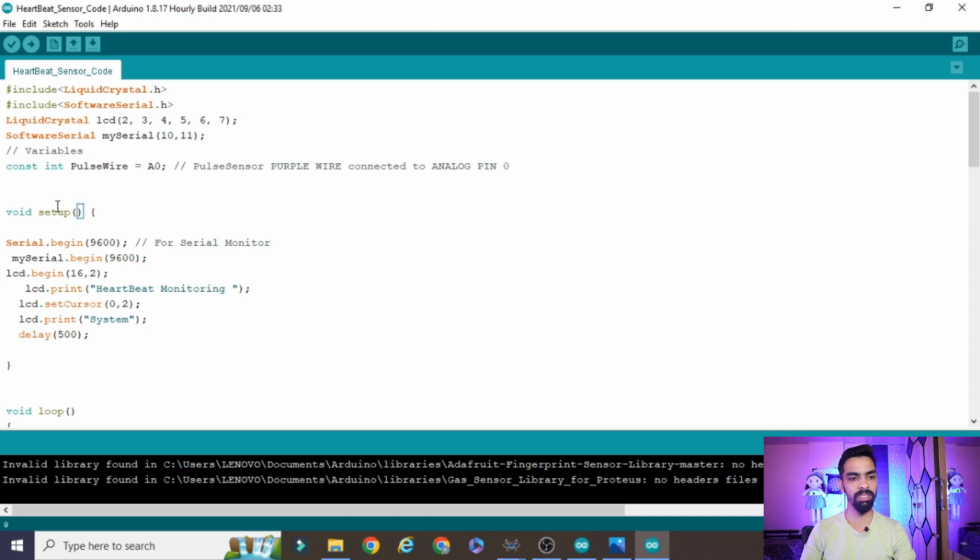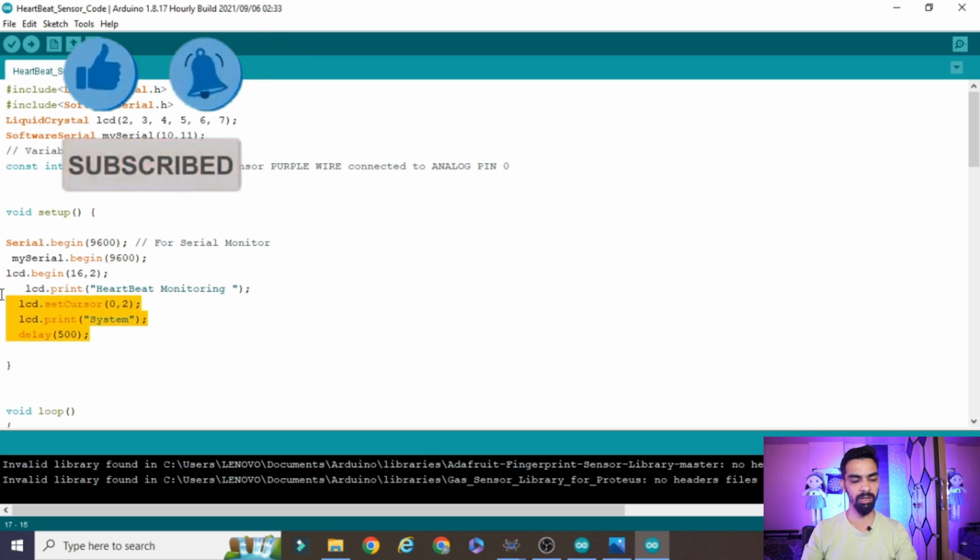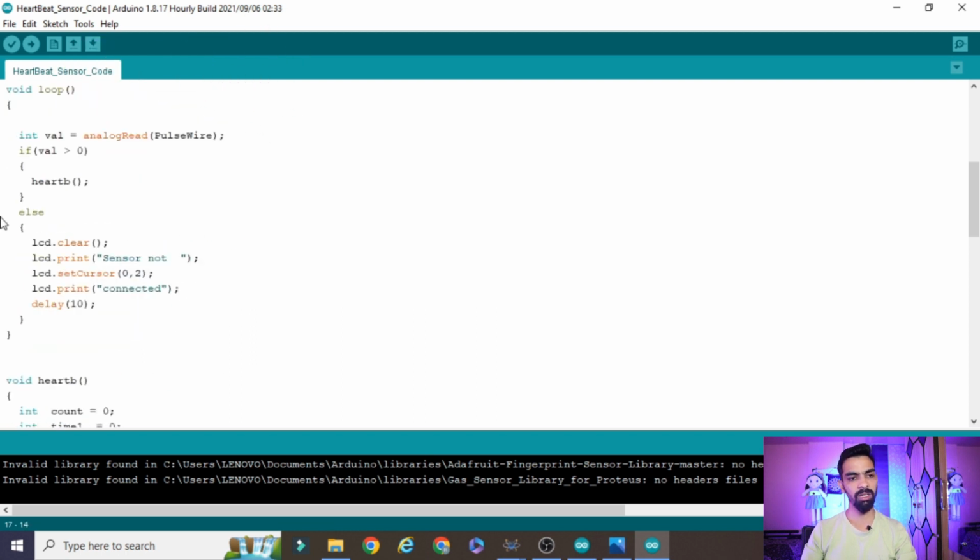Now in void setup, what we are doing is Serial.begin with a 9600 baud rate. Basically the baud rate selection for GSM communication is set by this line. Then we are using the 16x2 LCD, so that configuration is defined here. At the start we are printing heartbeat monitoring system on the LCD, so that message is defined here. Then the void loop starts, where our program logic actually starts.